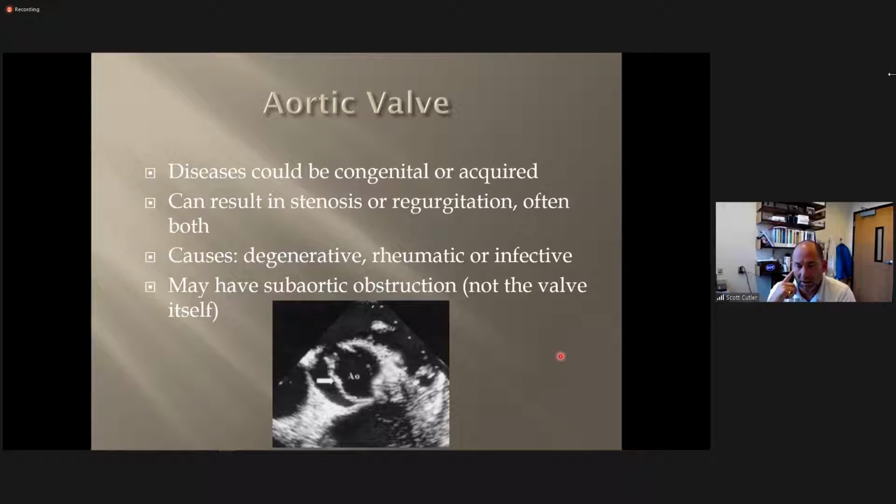Okay, the other thing that we get, so it might be like a big muscular bunch of tissue. It could also just be a band of tissue or a false tendon. You know, our tendons usually go from the muscle to the mitral valve on that apparatus, but maybe some of those span just across muscle to muscle and don't attach to the valve itself. And some of those can sometimes obstruct the flow as well, particularly if they become more broad or thickened. So we're just looking for anything that causes that flow to elevate and stream through that area. Okay, so we are paying attention to our Dopplers, but we're also paying attention to what's happening in 2D.